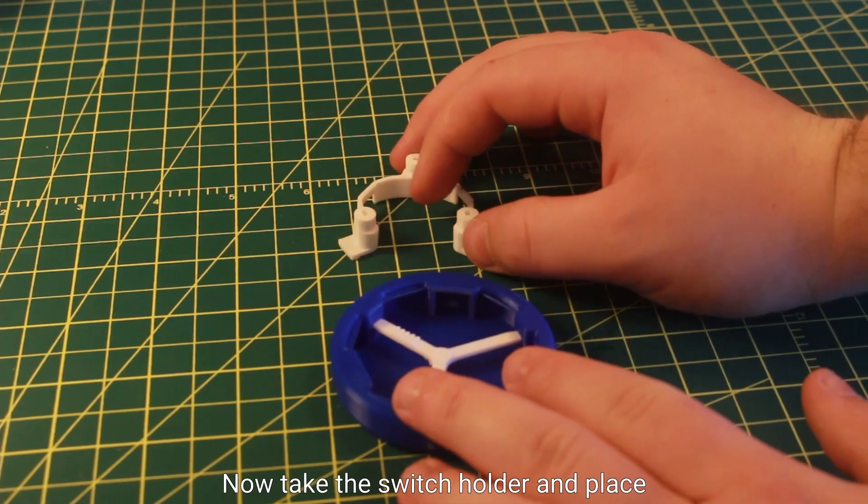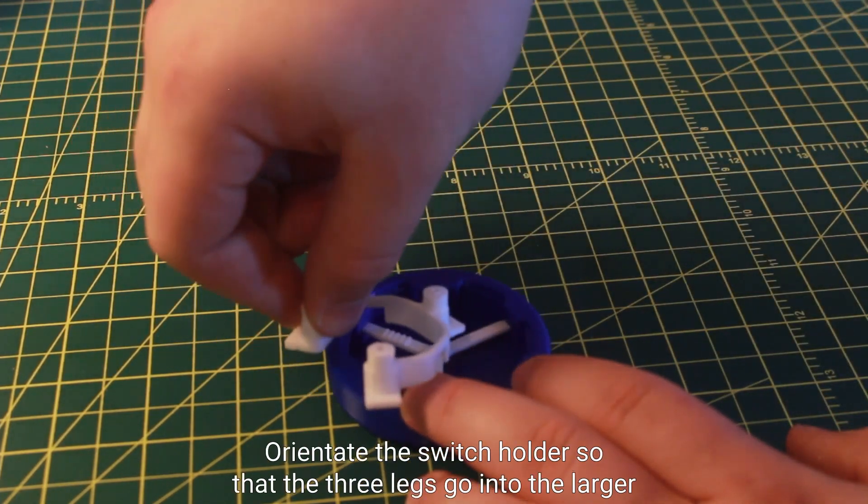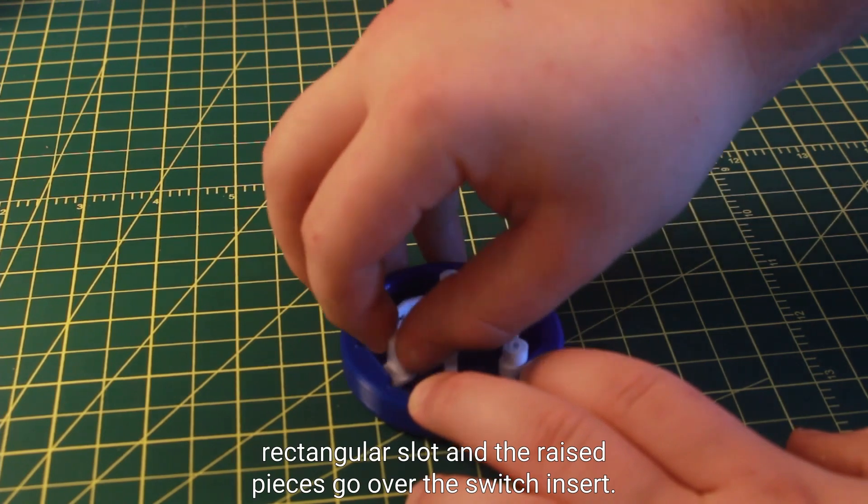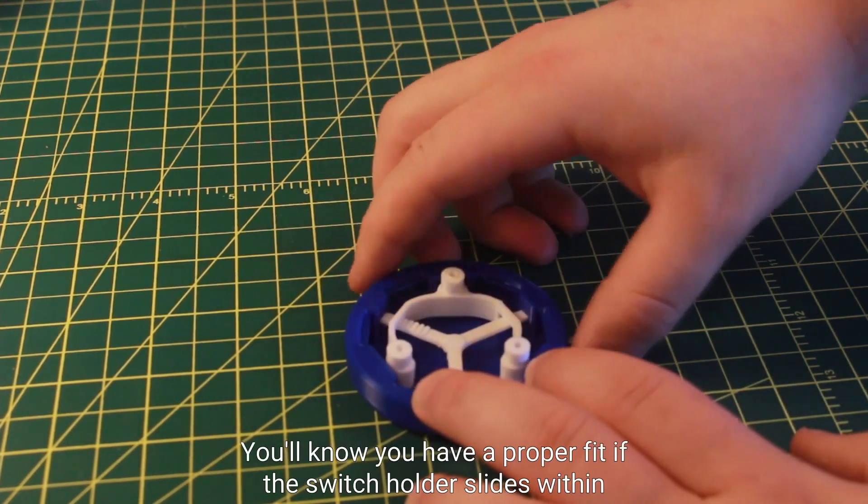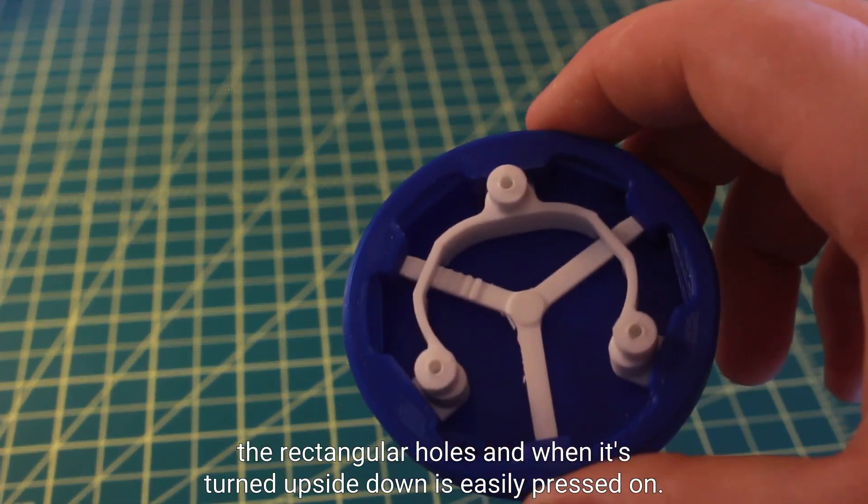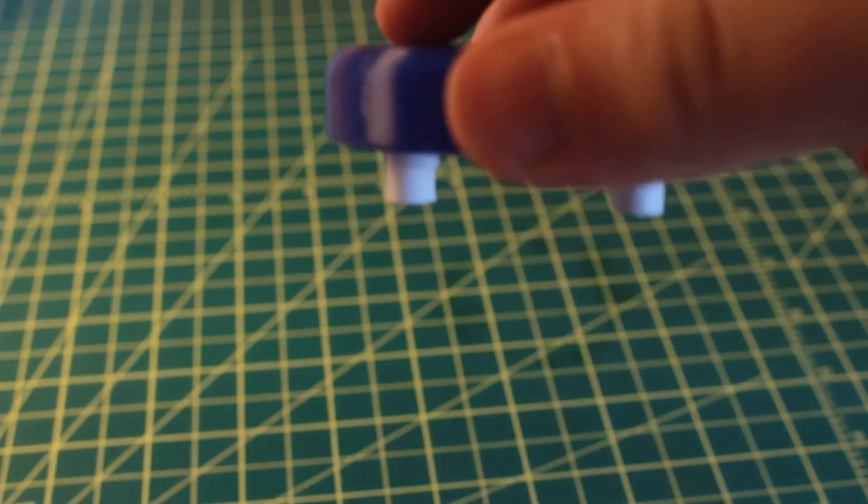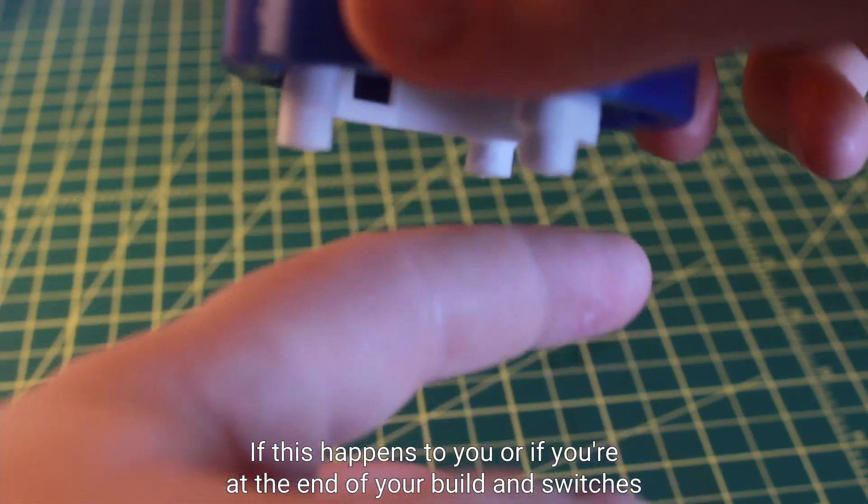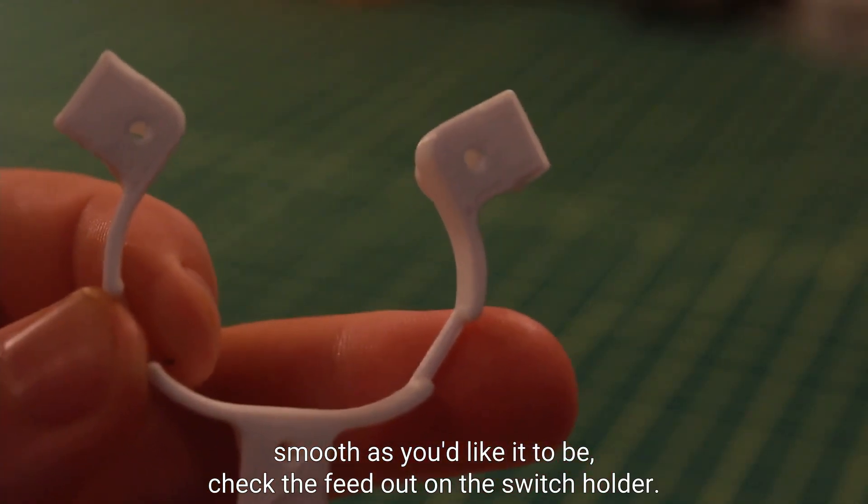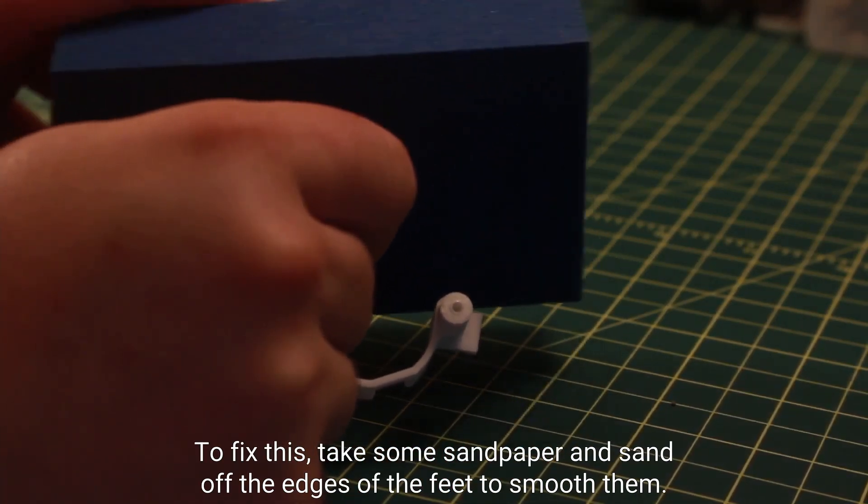Now take the switch holder and place it on top of the switch insert with the cylindrical holes facing out. Orientate the switch holder so that the three legs go into the larger rectangular slot and the raised pieces go over the switch insert. You'll know you have a proper fit if the switch holder slides within the rectangular holes and when it's turned upside down is easily pressed on. As you can see, one side of mine gets stuck. If this happens to you or if you're at the end of your build and the switch isn't as smooth as you'd like it to be, check the feet out on the switch holder. Some may have some excess filament causing friction between the components. To fix this, take some sandpaper and sand off the edges of the feet to smooth them. If you don't have sandpaper, you can use the flush cutters and cut a very small bit off the edges.